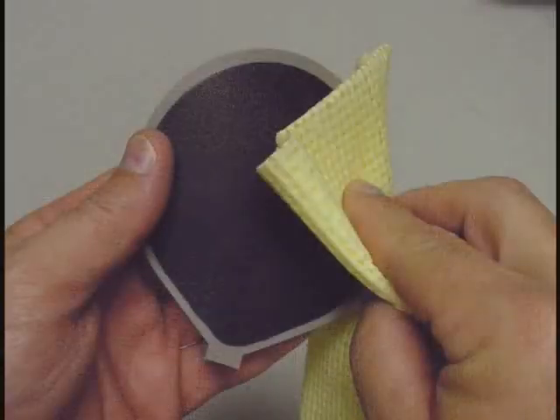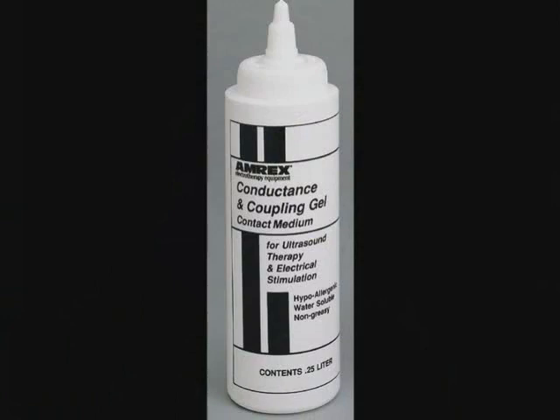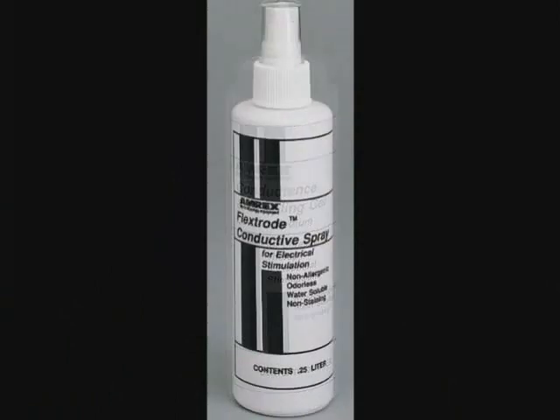The treatment site and electrode should be cleaned and properly prepared prior to application of electrical stimulation to the patient. We recommend that you use AMREX conductance gel or Flextrode conductive spray and cloth covers to thoroughly moisten the treatment site and electrode surface prior to every treatment.